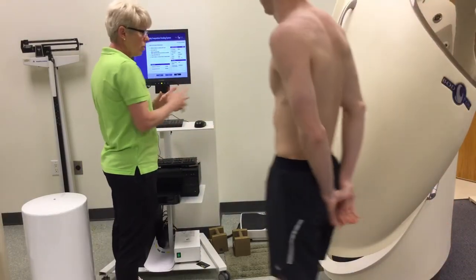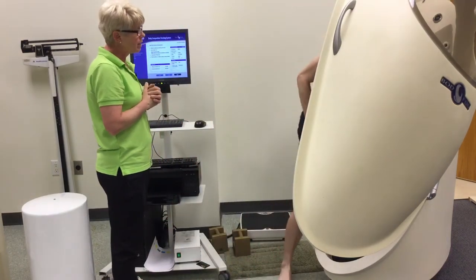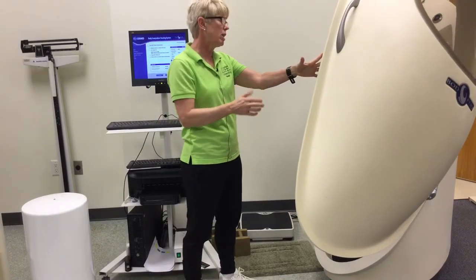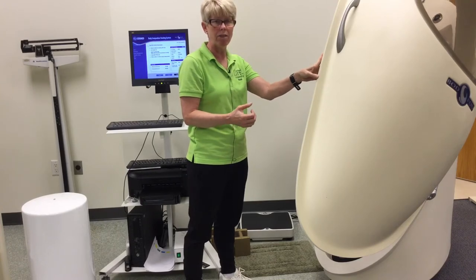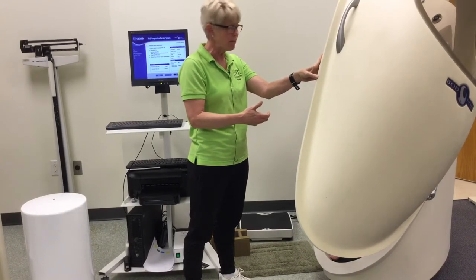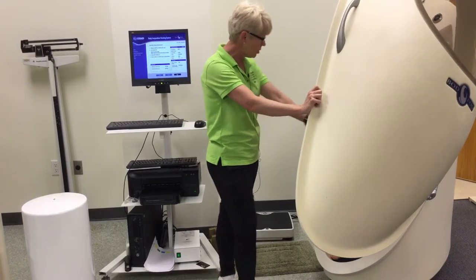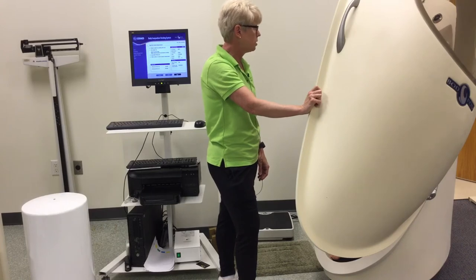Go ahead and have a seat in the bod pod. The bod pod doesn't lock — those are only magnets around the edge. You need to make sure that you reinforce with your patient or client. Ask about whether or not they're claustrophobic. Reassure them that this will not lock on them. At any point you want to stop the study, you just push that little blue button below your knees. Just sit still and breathe normally.